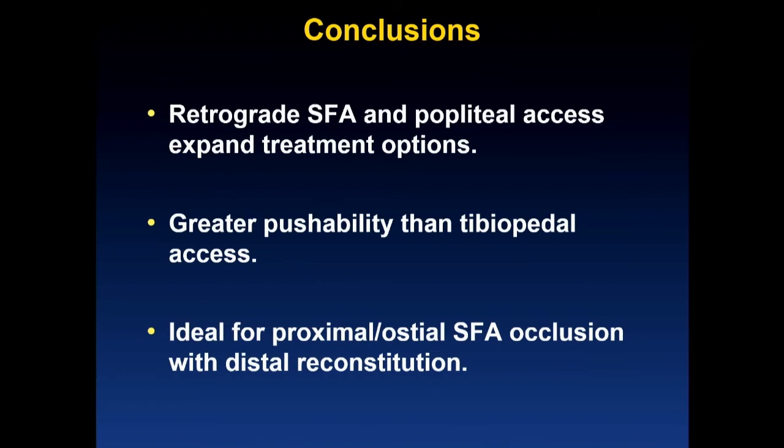One of the big advantages, of course, is that it does allow greater pushability than with tibiopedal access, and you can potentially upsize the sheath in order to perform re-entry as well. So I think in general, I would consider this an ideal technique for proximal ostial SFA occlusion with distal reconstitution.